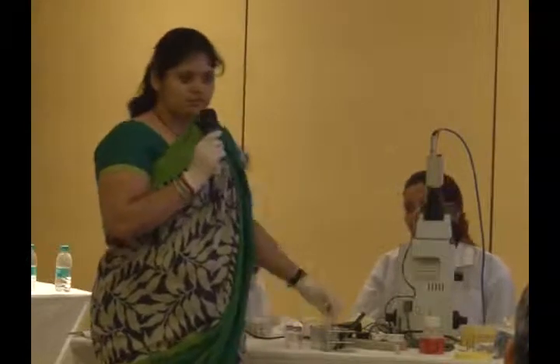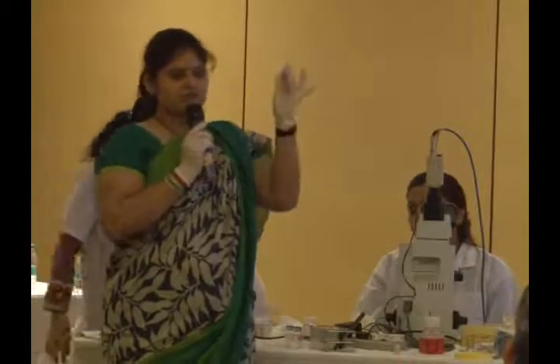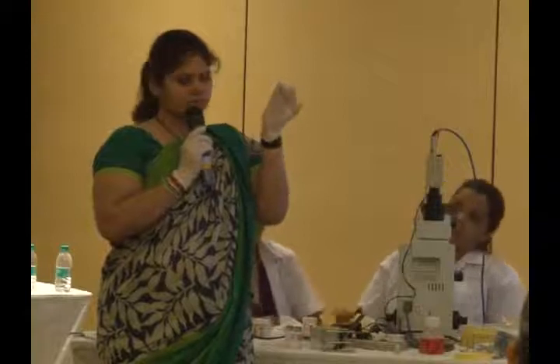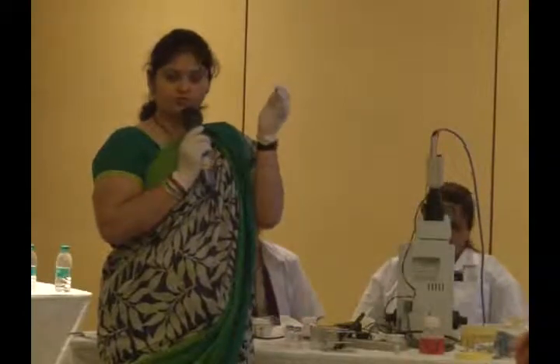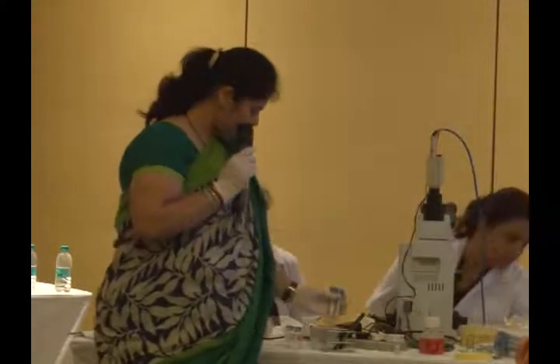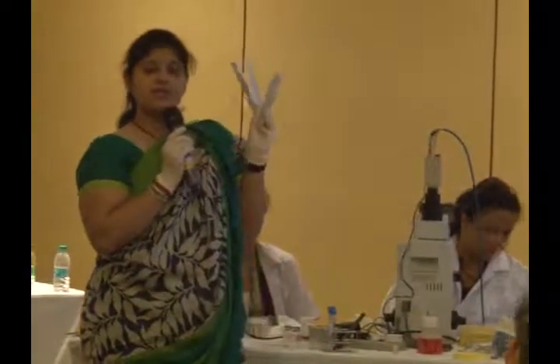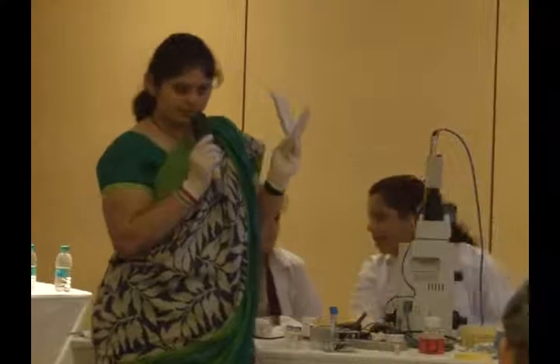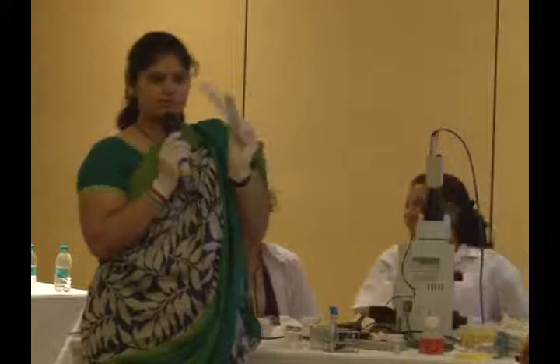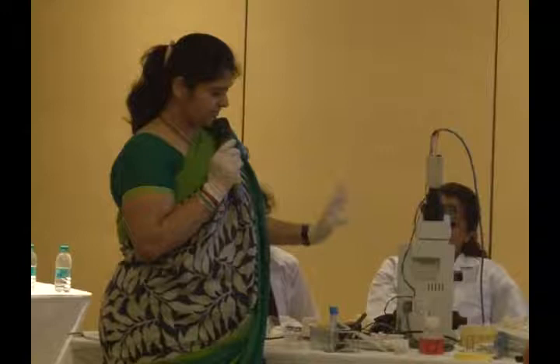When you do gradient, it means you are going to do centrifugation. So whenever there is centrifugation, you use a conical bottom tube. So you get a better yield here, because you will get a compact pellet at the bottom of the tube. So whenever you are doing centrifugation, use a conical tube. Then we have the transfer pipette, an individually sterile transfer pipette. One pipette you can use only once. You cannot repeat it. That is the thing in IUI. So it is very costly.